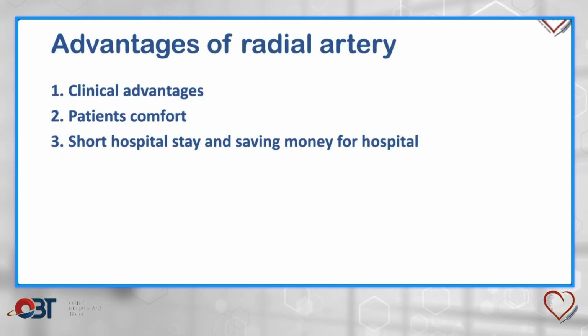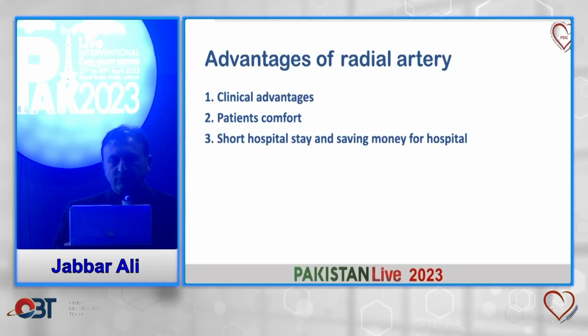It can be a clinical advantage because the radial artery is small and it is superficial and it can be easily compressed, and we know the bleeding is one of the problems during PCI, especially if you are doing acute cases. Patient comfort, as we know, if we are not using the closure devices, the patient has to lie for 12 or 8 to 12 hours, and short hospital stay, which will reduce the hospital expenses.